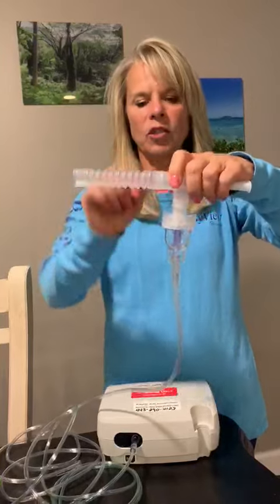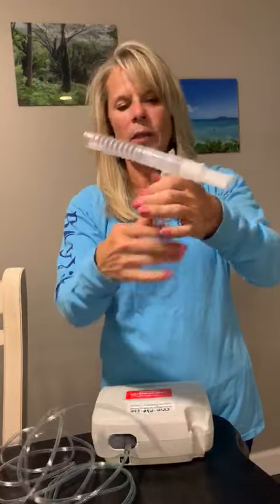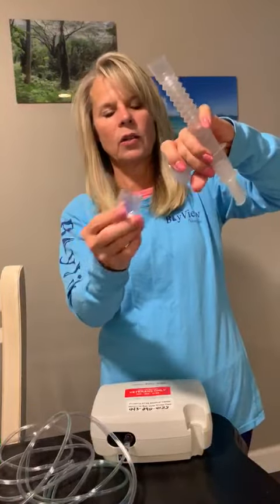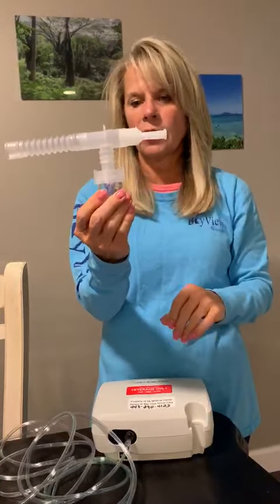If you're using the mouthpiece, you're doing pretty much the same thing. At the end of each treatment, remove the tubing, dump any contents into the sink or trash can, put it back together, and it's ready for the next treatment.